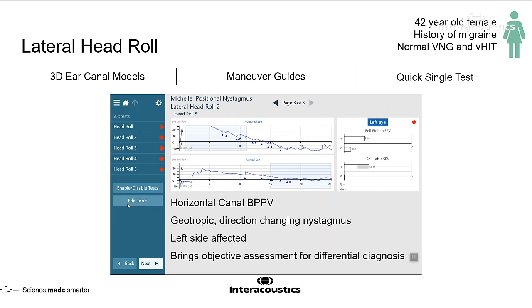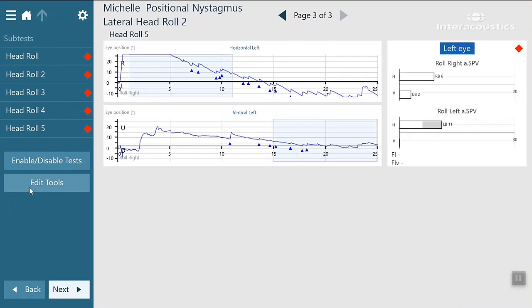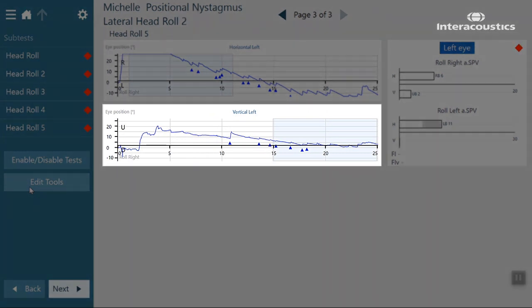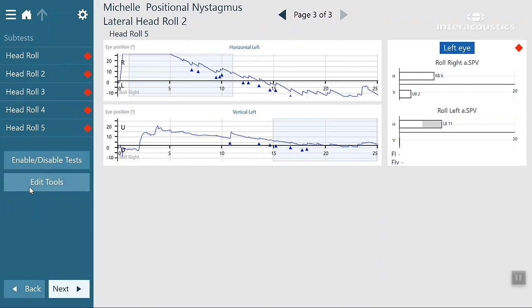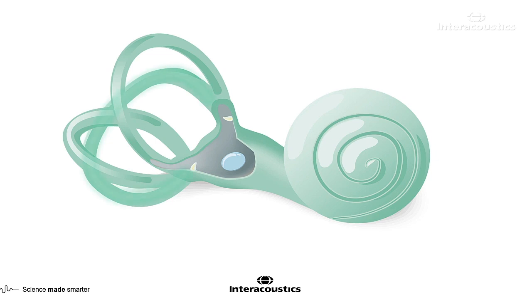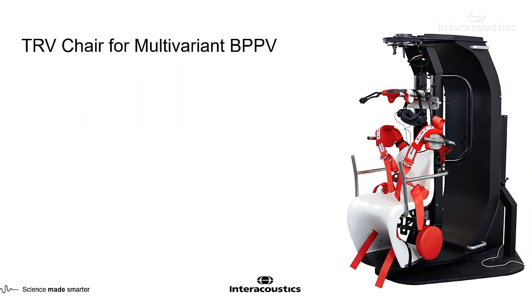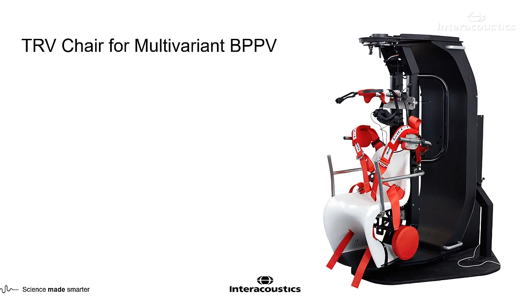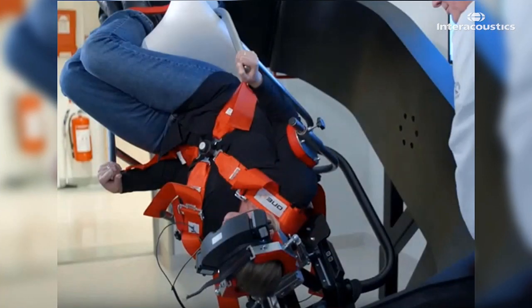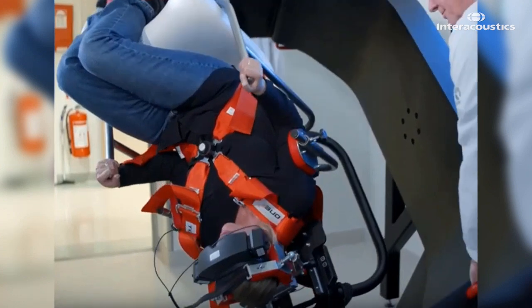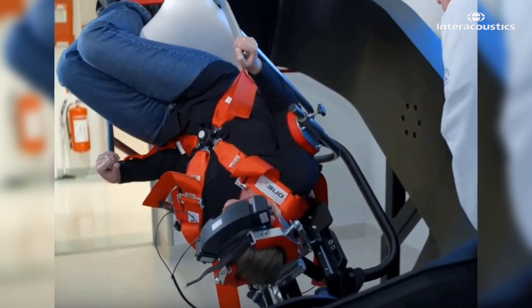Let's look a little deeper. Looking at the second graph for vertical left, we can actually see a few beats of up-beating nystagmus — maybe only 2 degrees, and the horizontal nystagmus was only 6, so it may not meet our qualifications for abnormal, but it's still a trigger that something might be going on. I think this patient has multi-canal involvement — both posterior and lateral canal. These multi-canal variants are very tricky to treat, so this would be a perfect case to put into a TRV chair, where we can precisely maneuver the patient and provide small shocks — kinetic energy — to help those crystals move back to the utricle more efficiently.